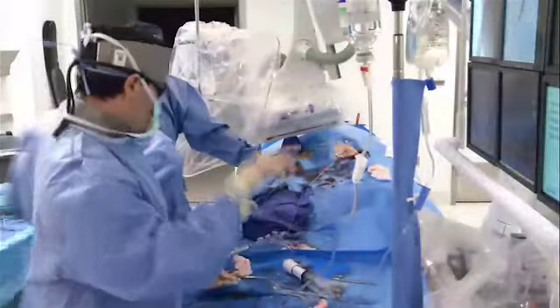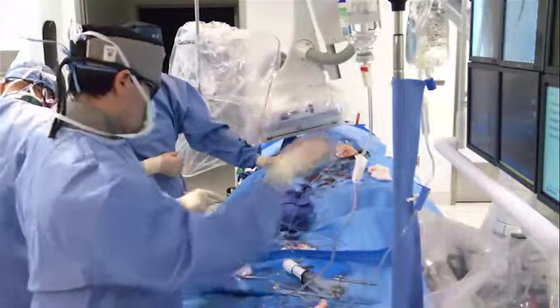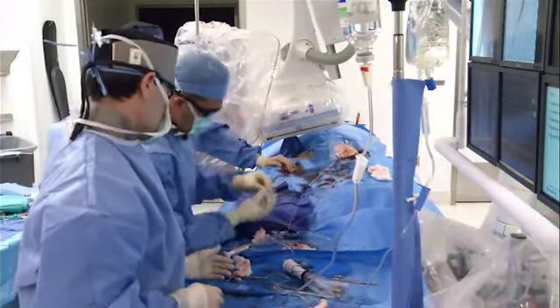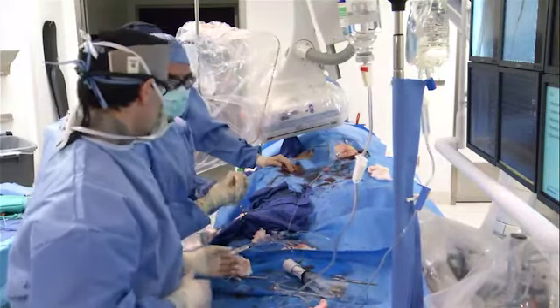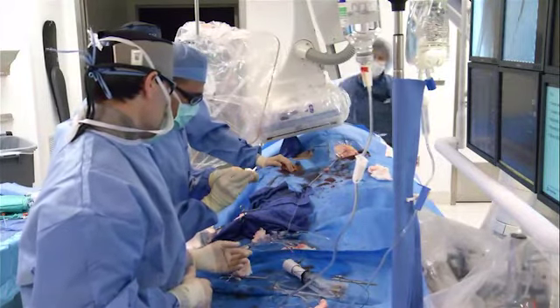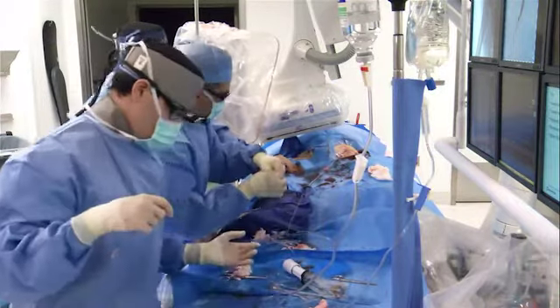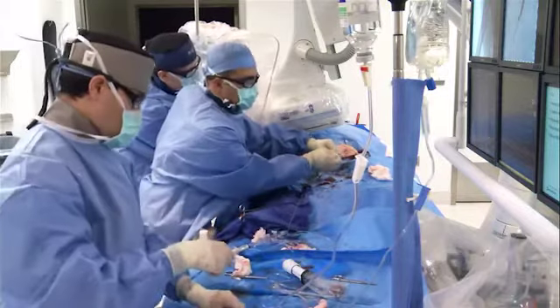I think, to answer Thomas's question from the beginning, that why didn't we go from the AT, I honestly am a little bit uncomfortable doing all this pulling and pushing and all the force that I need to get that sheath down, given the distance from the AT and given the fragility of the AT. So I don't know, that's just me. I mean, I guess you can do it. But I felt like we really needed a lot of force. We needed an 035 system. We needed a hefty system to be able to get down. And I felt that the popliteal stick was not that risky.